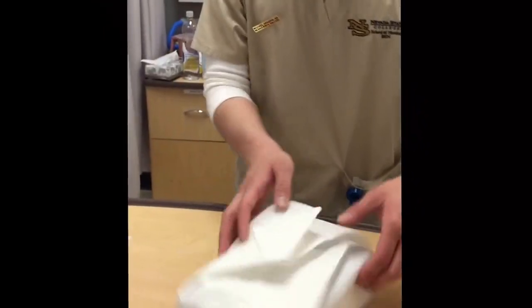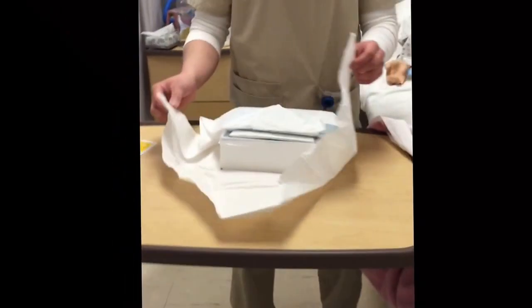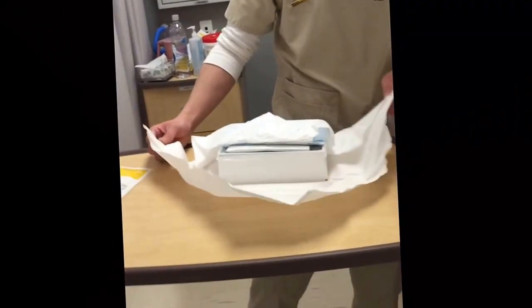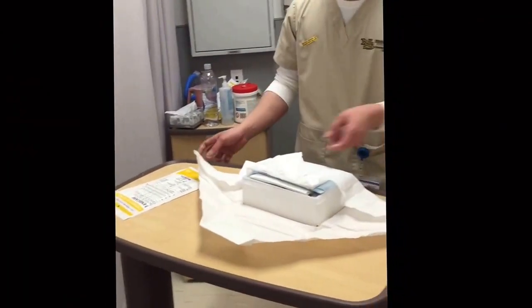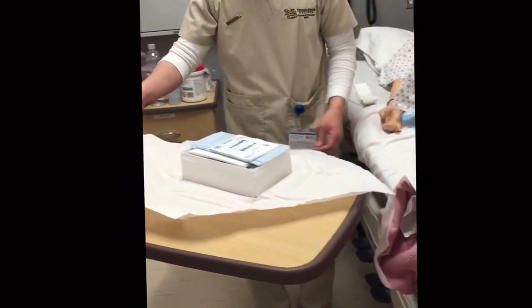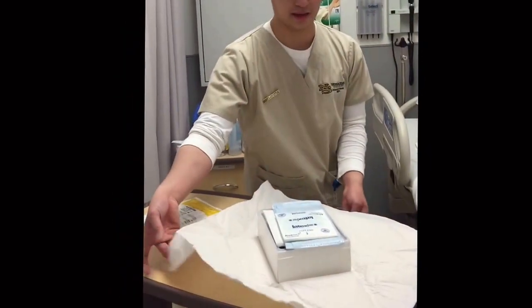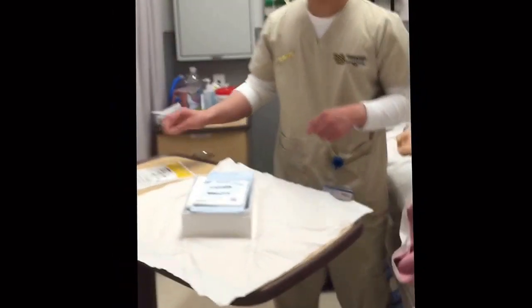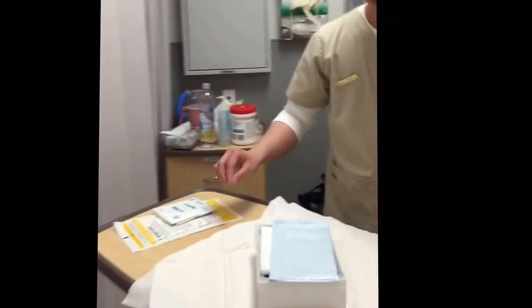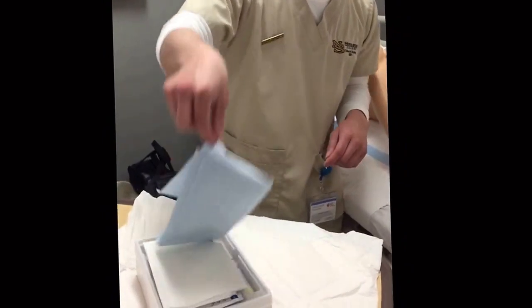Alright, so now you can open this. Make sure you open the part away from you, and just flap. And make sure you're close to your patient. Okay, so now that you're doing okay, this is also a sterile field. So make sure you're not contaminating anything. Make sure you have enough space to work with your patient. So now you can put this on her for her safety measure.